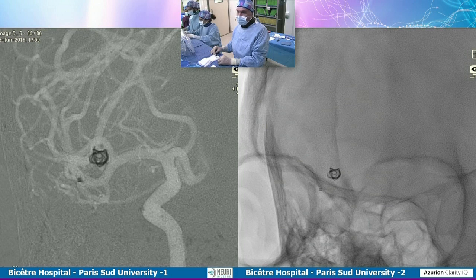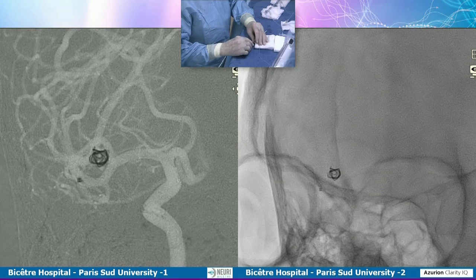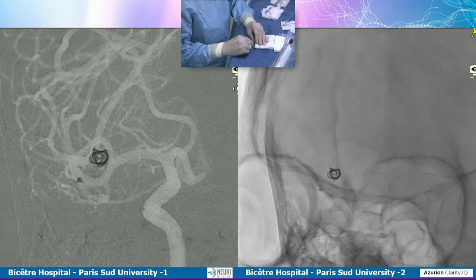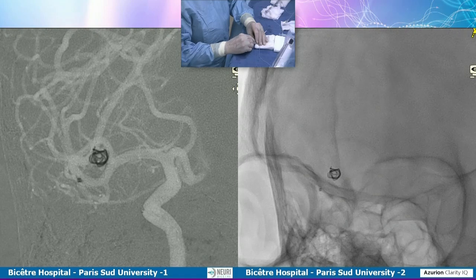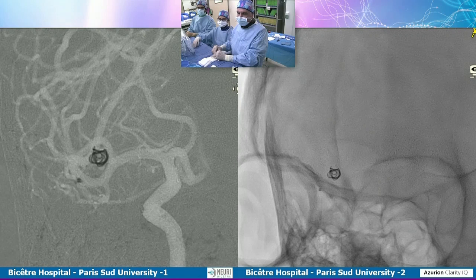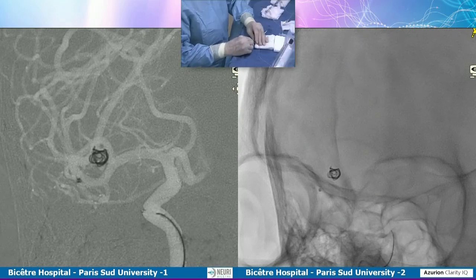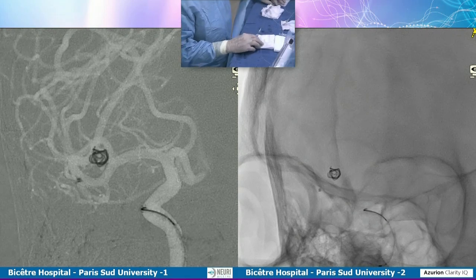Usually, in most of the cases, you place the flow diverter in the biggest branch, the one which is straight, and in most cases it's the posterior branch, which is the biggest one, the biggest territory. So I prefer to cover the upper branch. We almost always go in the inferior branch and cover the upper branch. And technically, it's much easier to do as well. But are you not more comfortable knowing that if you have an acute thrombosis on that branch, you will have a collateral supply to this branch more than for the upper branch, the lower branch?